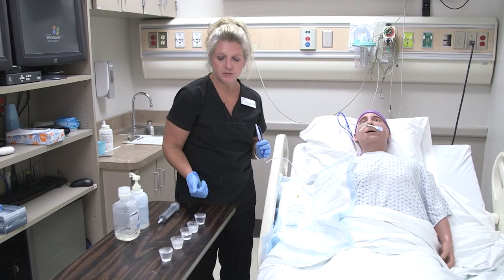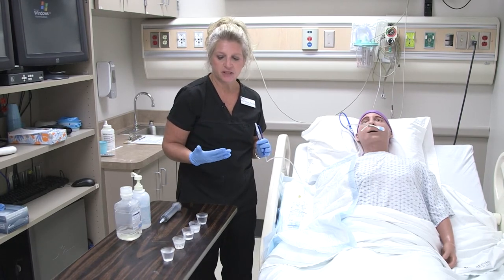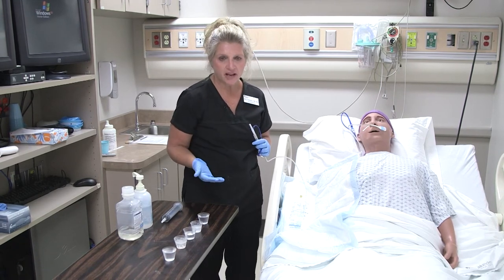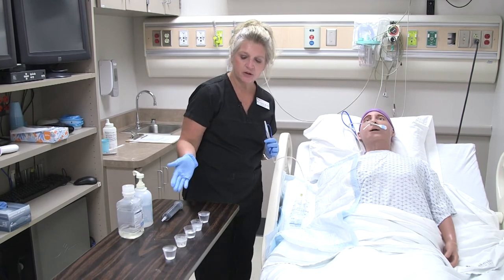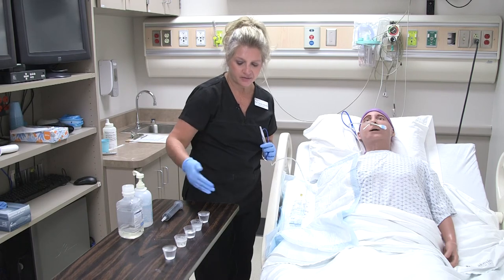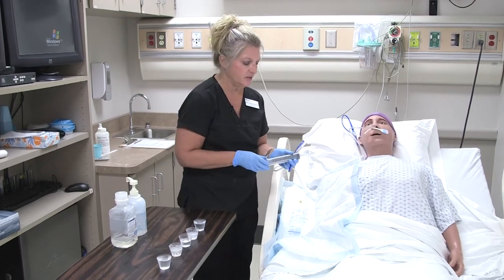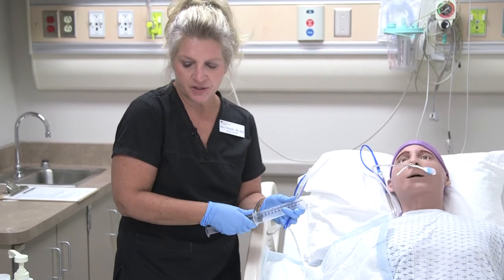If the patient is on a fluid restriction, you'll need to figure that out. Some patients are limited to only so much free water during your shift. You have to count all of that when giving medications, because you're using sterile water or tap water as per policy — whichever your facility uses — and you have to include that in their intake. We're going to start by flushing the tube to make sure it's patent, by gravity.